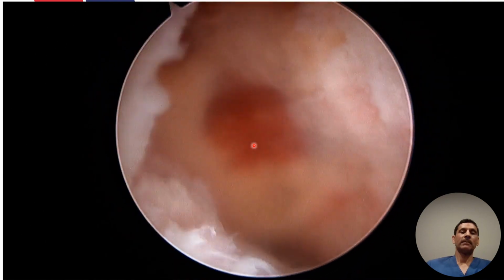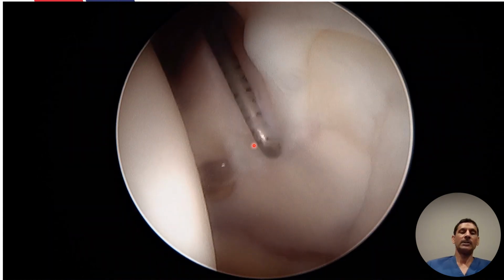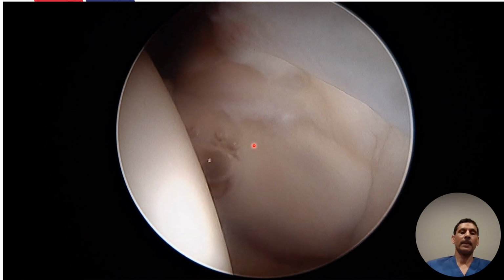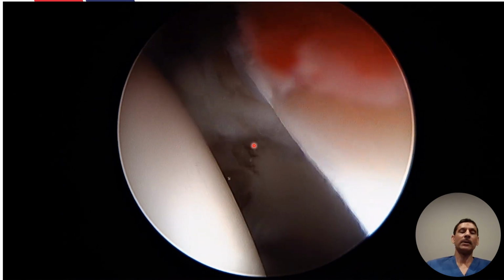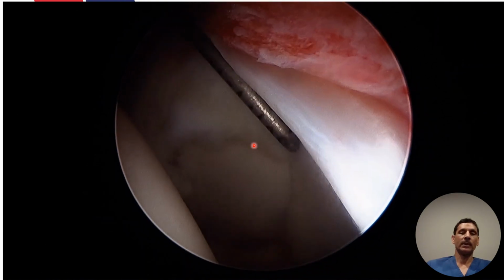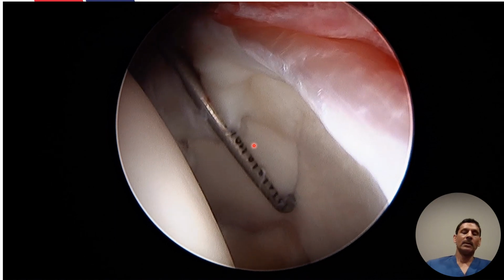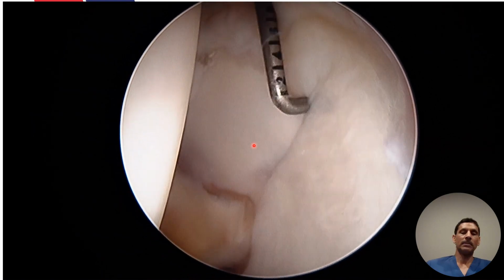So that's the last little bit of connection between the 2 portals. And now we are done. Then we start diagnostics. Look at the labrum. That's pincer damage of the labrum. The labrum got pinched between the femoral neck and the rim. Cam and pincer diagnosis should be an intraoperative diagnosis, looking at the damage pattern, and not a preoperative diagnosis based on coverage or cam morphology. Palpating the cartilage for health. See how the labrum is all crushed and rounded and red. That's a normal cleft, an embryological cleft in the acetabulum, being palpated.